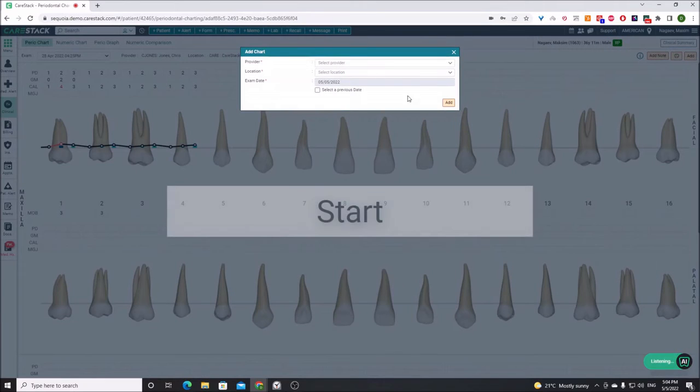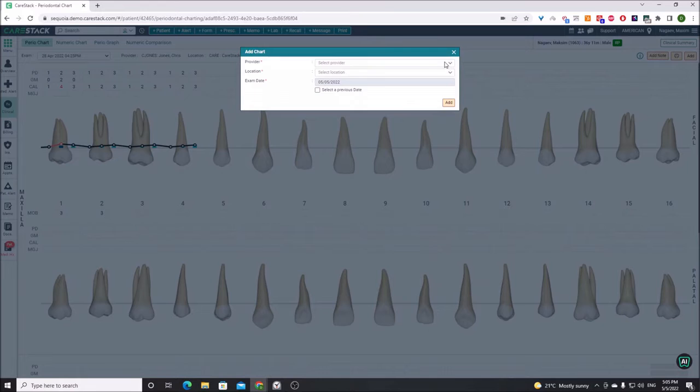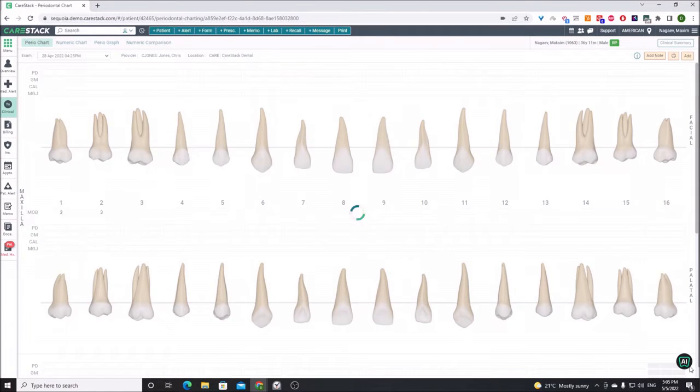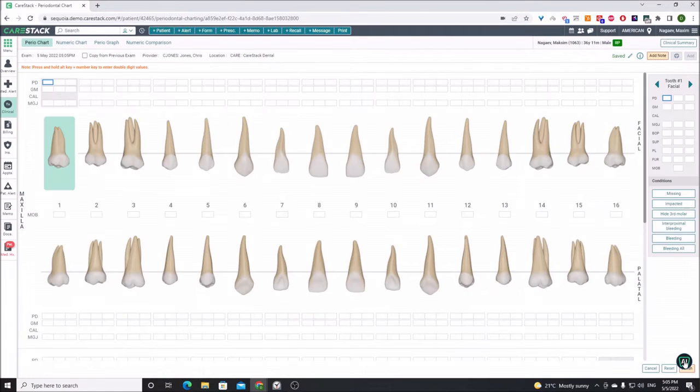I need to add a new chart. All right, now we're good to go.